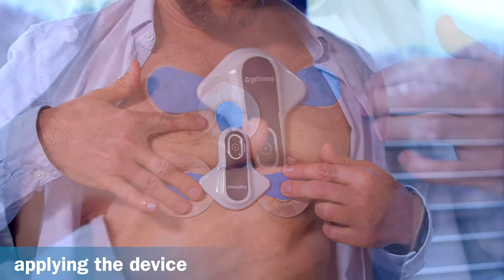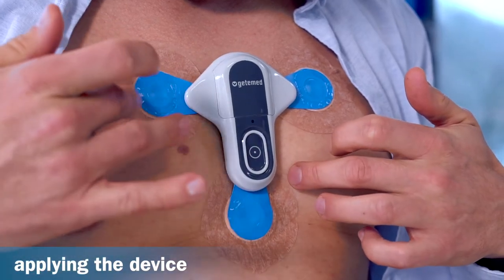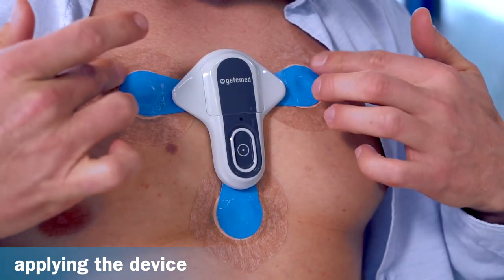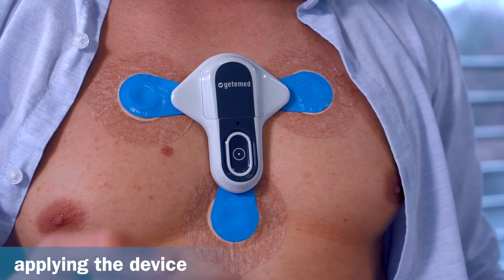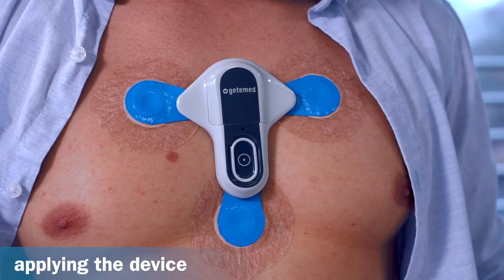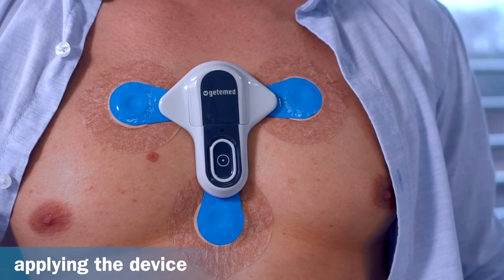Once you have made your decision, gently press the recorder with the electrodes attached onto the chest. Press down the edges of the electrodes to make sure that they are firmly attached. Next, start the recorder by firmly pressing the button.